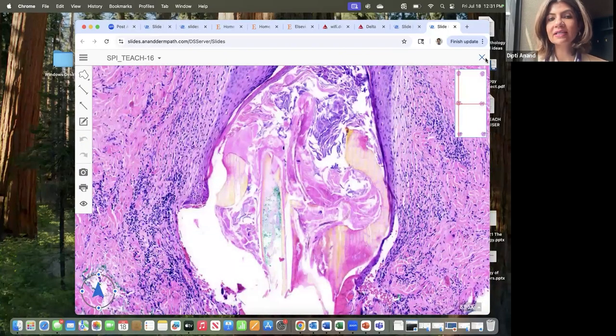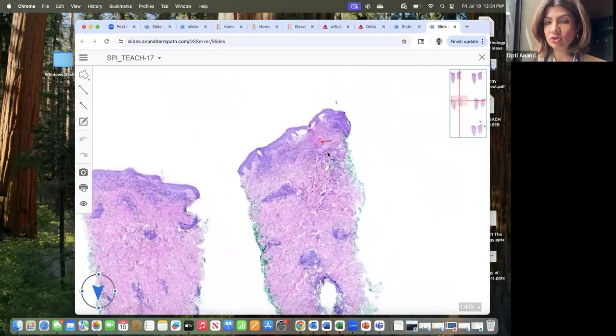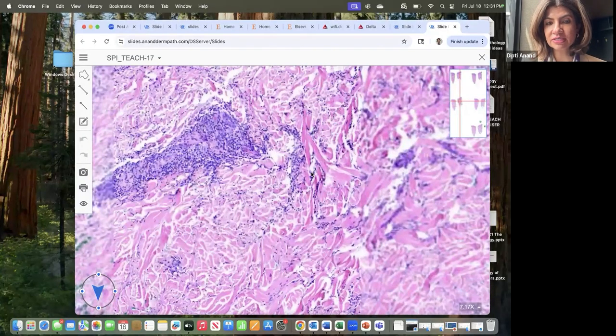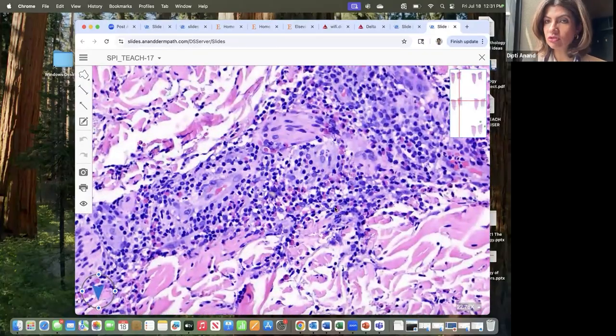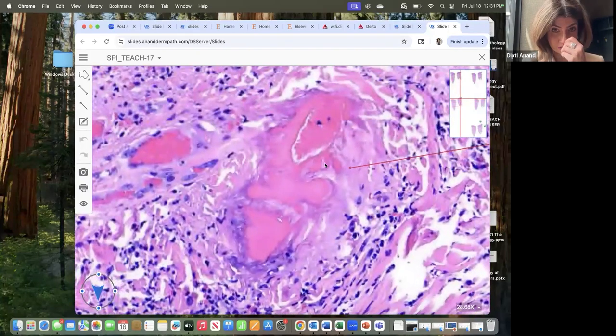Okay. And then lastly is going to be what is referred to as the cone of cement. So here you can see there is a superficial and a deep lymphocytic infiltrate. And when you go up on high power, you are looking for the presence and the absence of eosinophils. And what you see in here are a ton of eosinophils. So this goes very much for an arthropod assault. But what you see over here is what is referred to as the cone of cement.